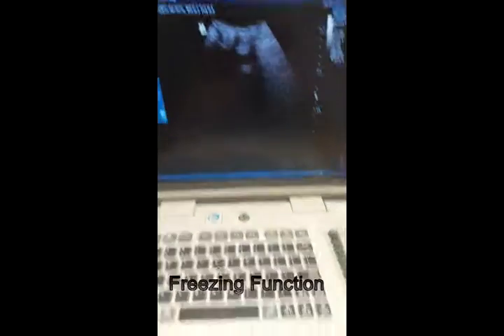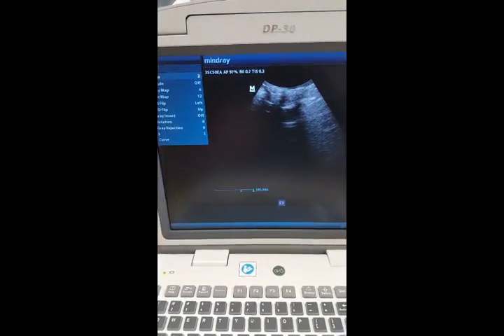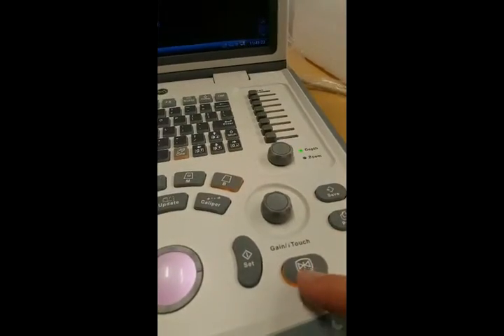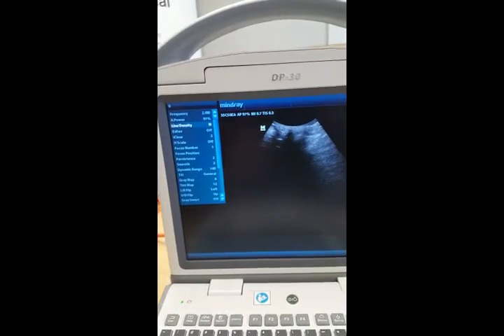If you want to freeze, you just press the freeze button, and that freezes the screen, and then you can do your measurements if that's what you need to do. To unfreeze it, just press freeze again and we're back to the live screen.